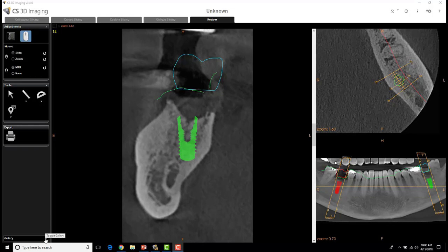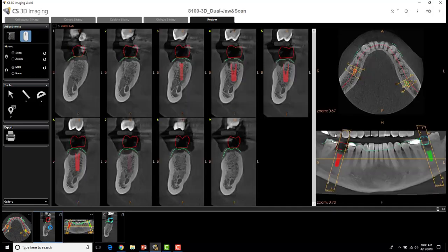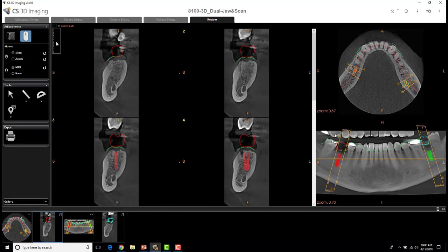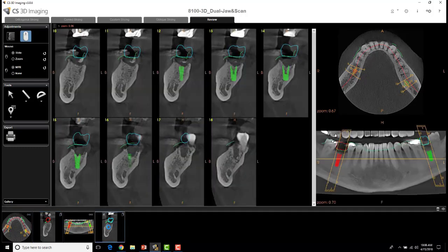So where are the other slices for the other implant? All you have to do is go to the gallery, and you'll see that each of the implant views has these little layers showing that it's giving you a cross-sectional report from each of those slices. If you want to bounce back and forth between implants to view their slices, you can just double-click on the icon that has these multiple layers. Now I'm seeing the nine slices for the other implant, and I can do the same exact thing — rows of two, rows of five, or whatever I want to do — and go back and forth between both.